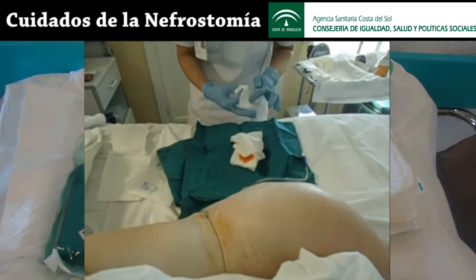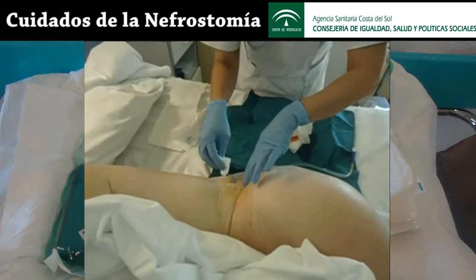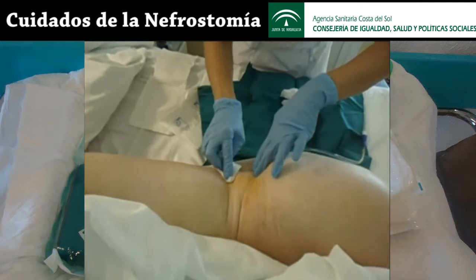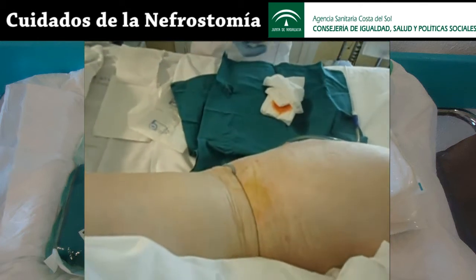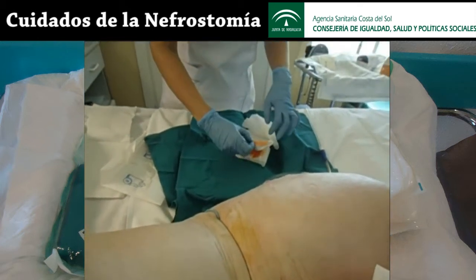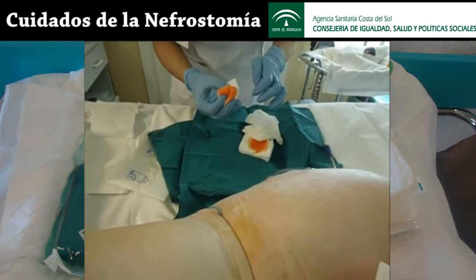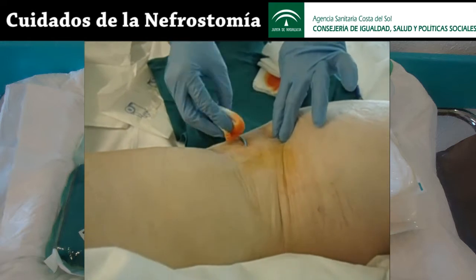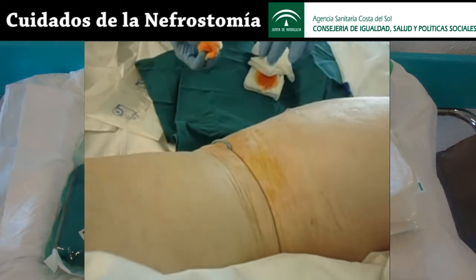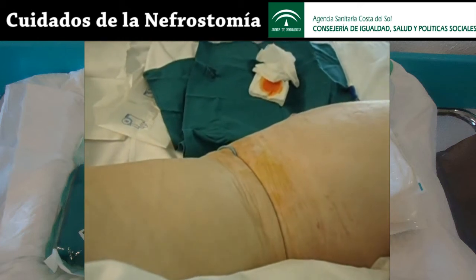Take some gauze pads with the saline solution and clean the area around the nephrostomy tube. Take the gauze pads with the chlorhexidine antiseptic solution and wipe the skin in circles, moving away from the tube entry site.